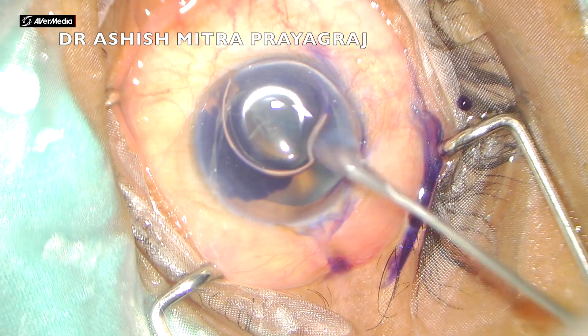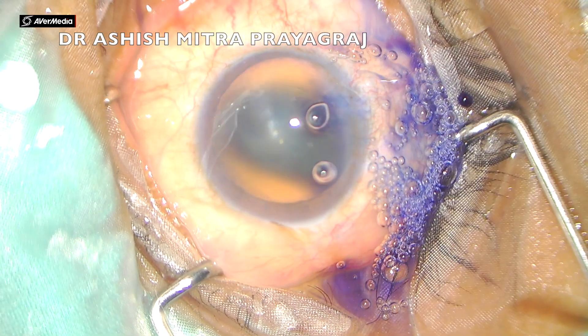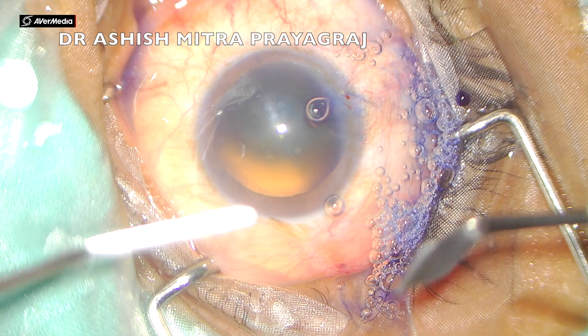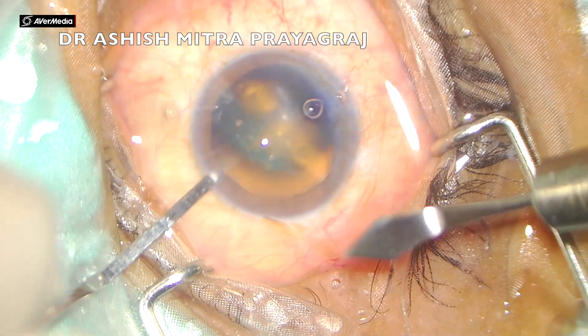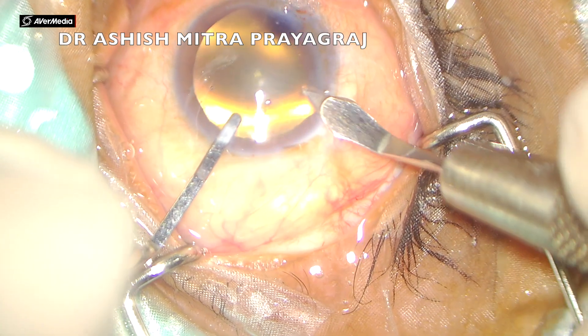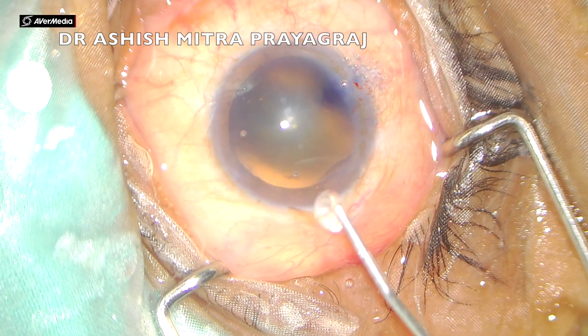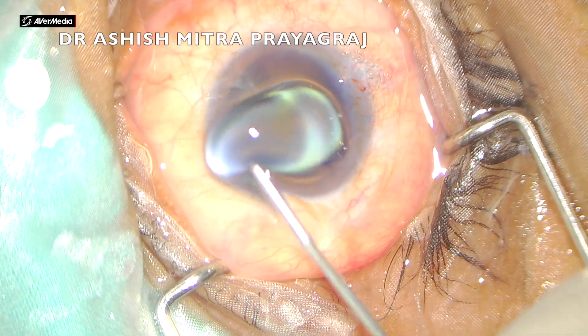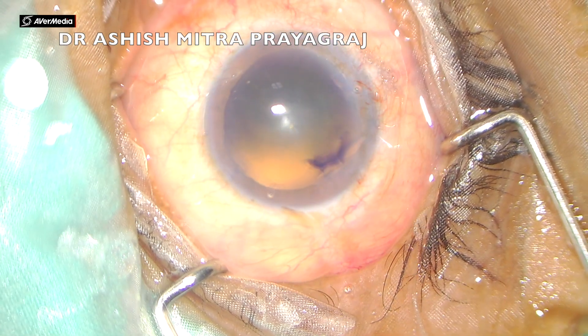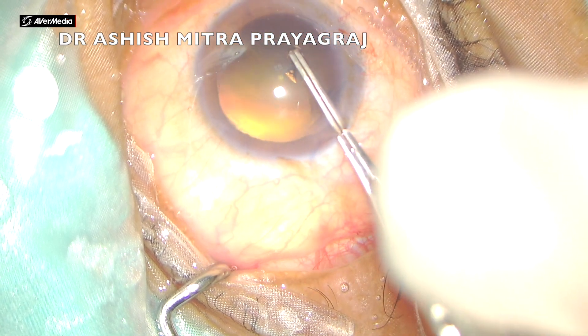Now let's watch what I did in managing this cataract. After making two side ports, the dye was injected — though the dye here was not really needed because there was a good glow. I always make a triplanar incision, and now I'm injecting viscoelastic to protect the endothelium.